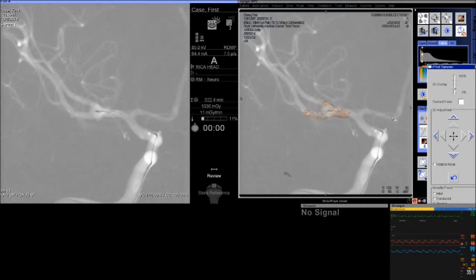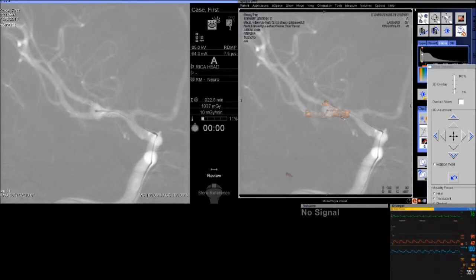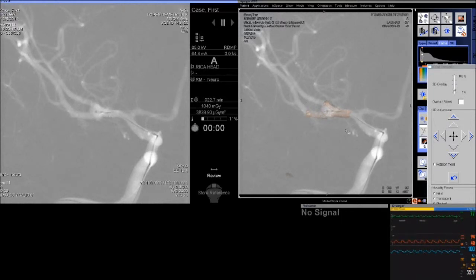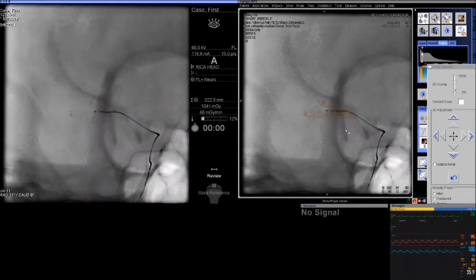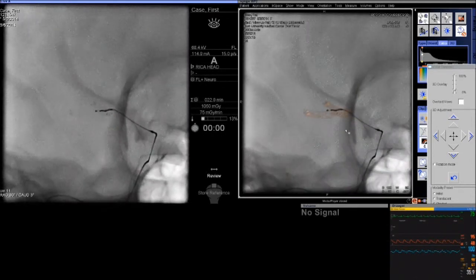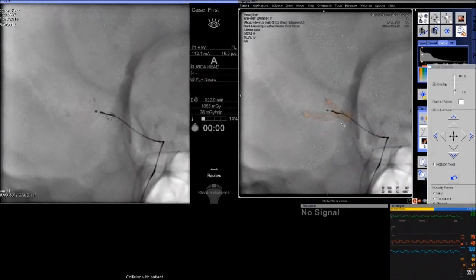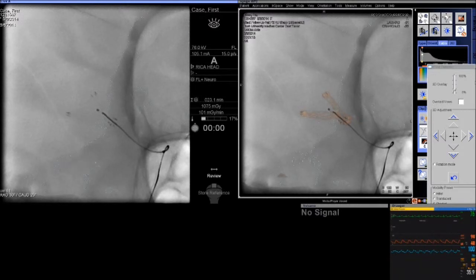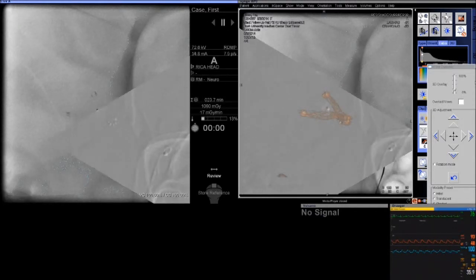In this case we have to place the microcatheter very carefully into the aneurysm because it is a multi-lobed aneurysm — the daughter sacs carry an extremely high risk of possible rupture. One can fade in and out the overlay to visualize the device as well as the boundaries of this complex anatomy. Once we're comfortable that the microcatheter is in position, we confirm in multiple views and position our imaging tube at the best angle to begin the coiling procedure. Using single plane and these overlay plus 3D roadmap techniques allows us to use much less contrast and radiation — particularly important for a patient with polycystic kidney disease.